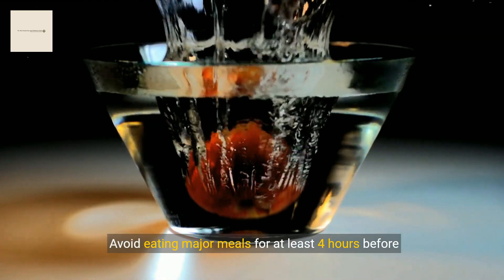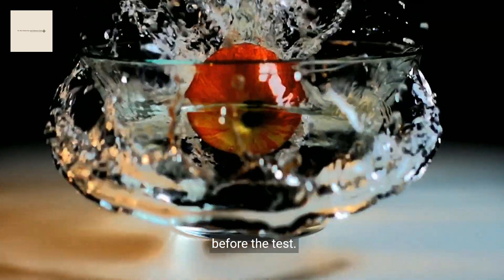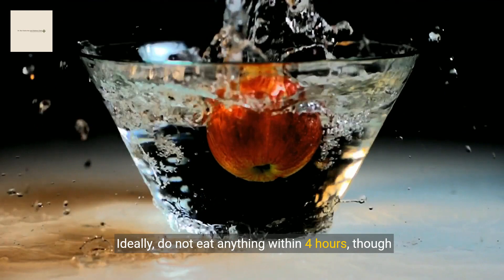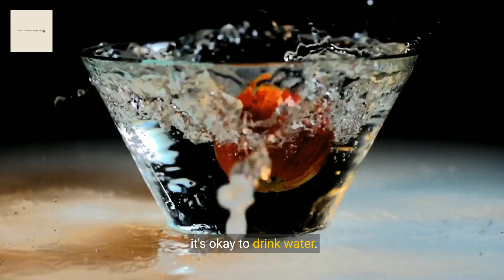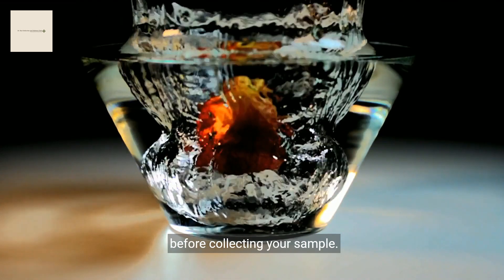Avoid eating major meals for at least 4 hours before collecting your sample, and no snacking for 1 hour before the test. Ideally, do not eat anything within 4 hours, though it's okay to drink water. However, do not drink water within 30 minutes before collecting your sample.